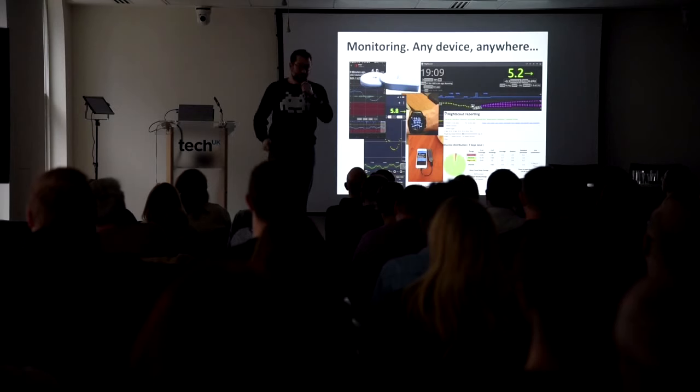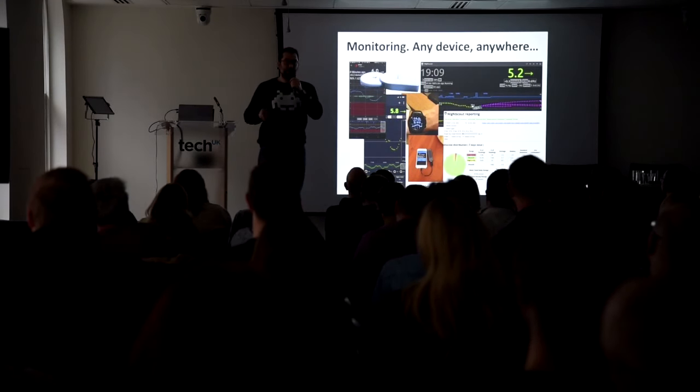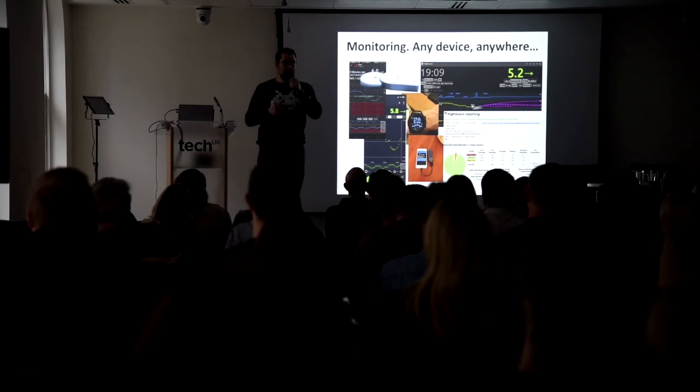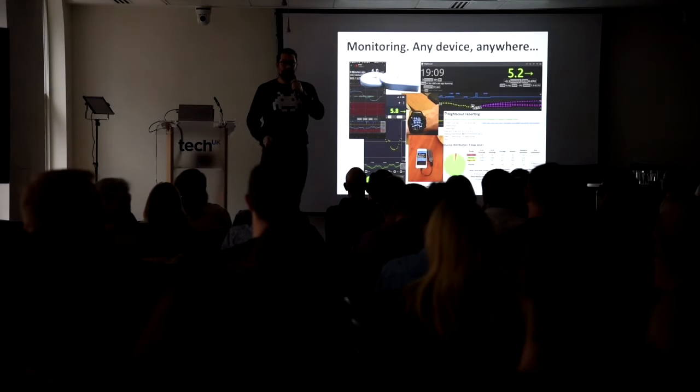Yes, it only works on Android, but it's a damn sight better than having to lift your pump out every time, especially if you don't wear your pump on your hip as a useful device. So having all of these devices available to you to look at anywhere is a key point of what DIY has delivered. And that's what we encourage people like Dexcom and Medtronic to do more of.